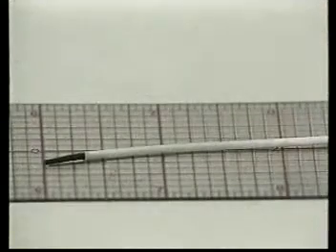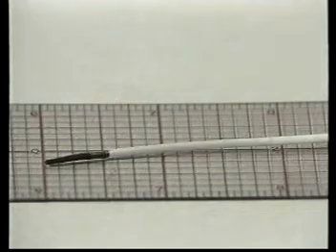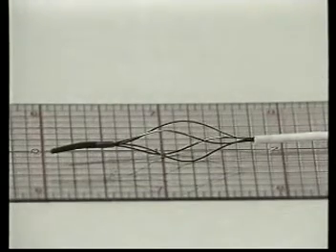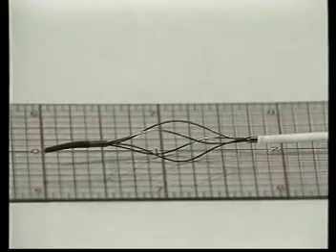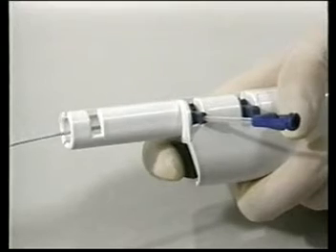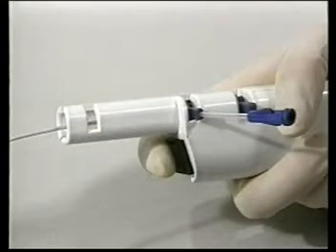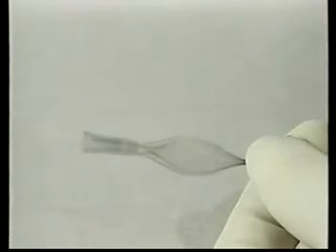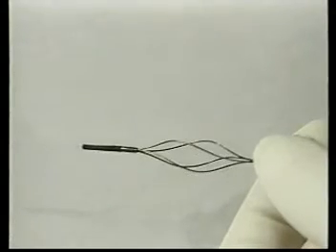Note that as the outer sheath is pulled back, the basket remains stationary while being deployed. With the fragmentation basket in the deployed position, depress the on-off switch. The fragmentation basket should spin while the switch is depressed. Spinning should stop as soon as the switch is released.